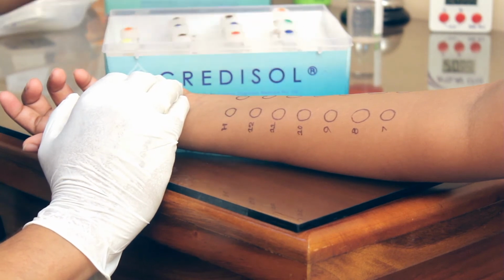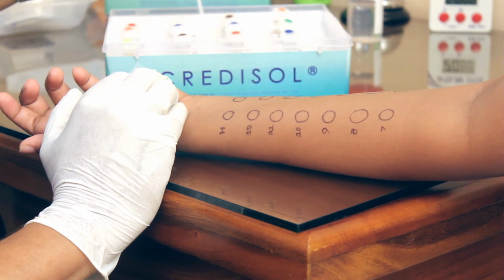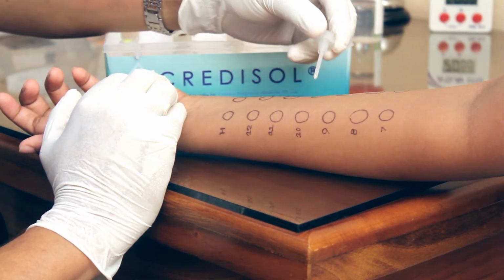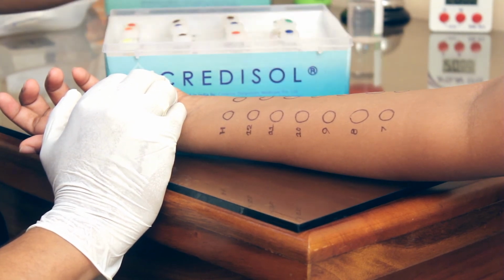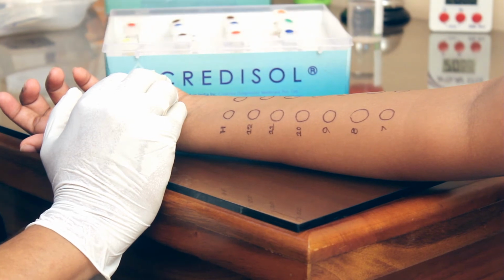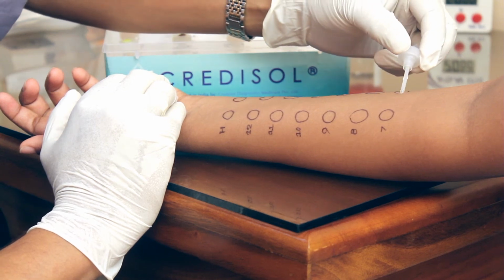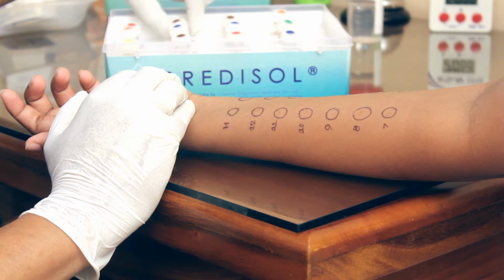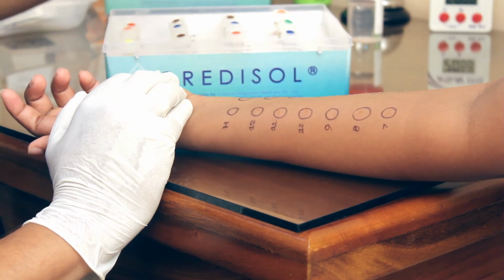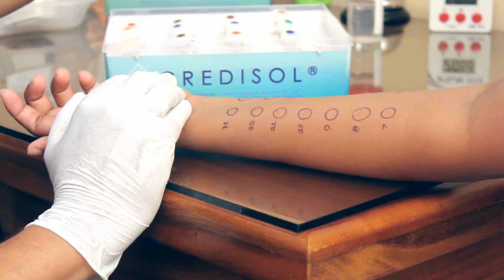So this is number 1 allergen, number 2, 3. Likewise you go on placing the allergens, and also you place the histamine control as well as the saline control.